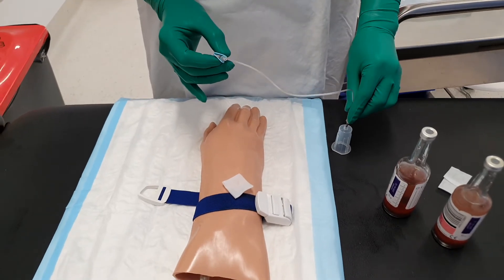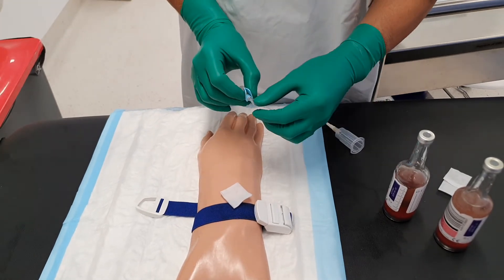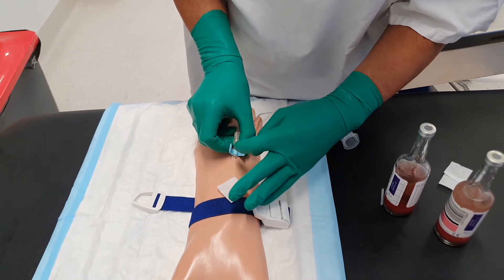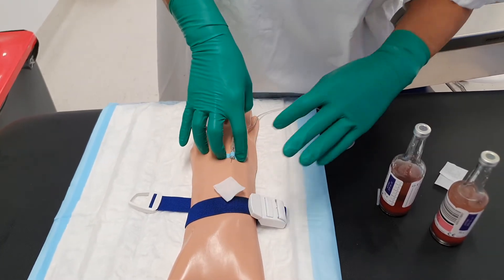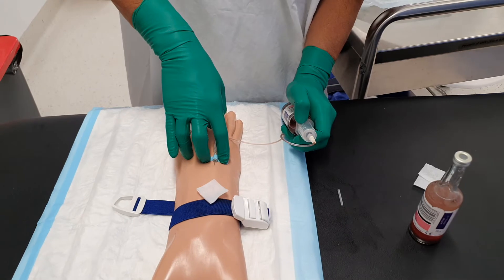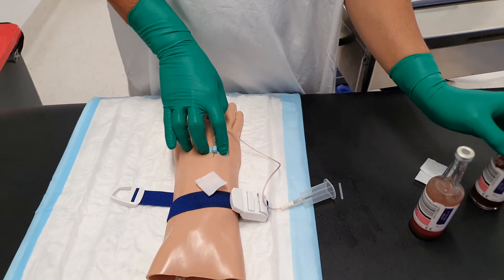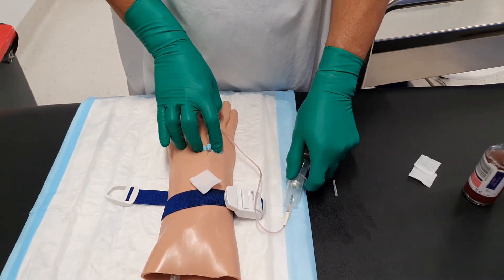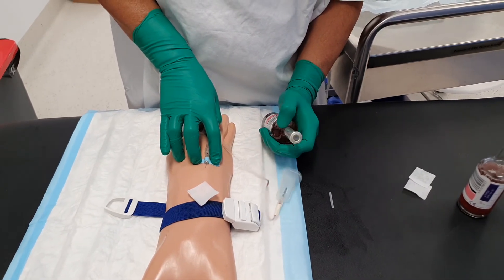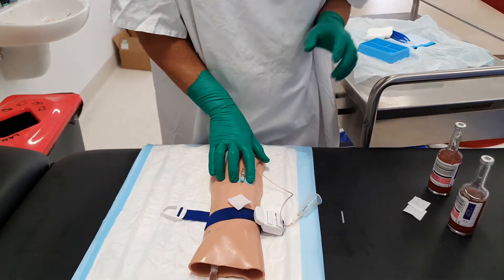I'm going to take my butterfly cannula, screw it into the barrel, and take my blood sample — just a scratch. Now that it's secure I can take the aerobic bottle first, fill that up to the prescribed volume — usually eight to ten mils — and then take my anaerobic bottle and fill that up to the prescribed volume again. If I need to take any other bloods, that's fine, but always do your blood cultures first.